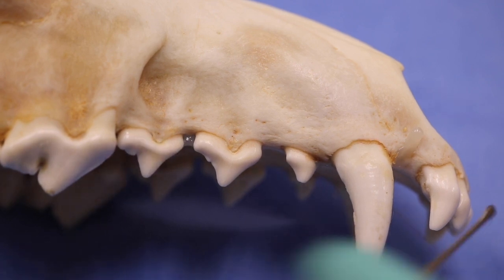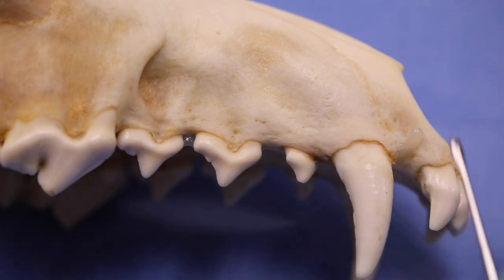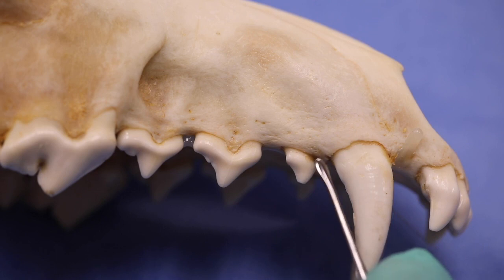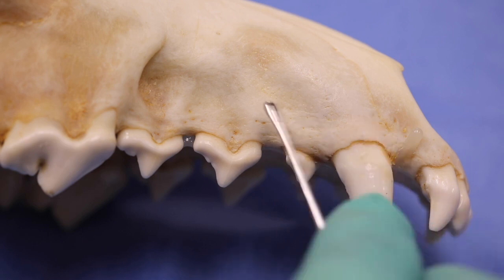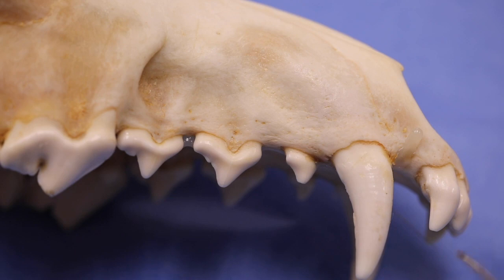premolar here, and then we use the periosteal elevator initially with the small end, especially on the corners and between teeth, to facilitate a safe elevation so that we can remove the bone over the canine tooth in this case and make it an easier extraction by utilizing maximal bone removal.